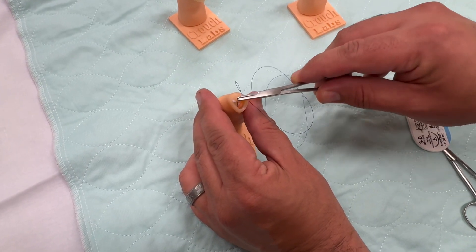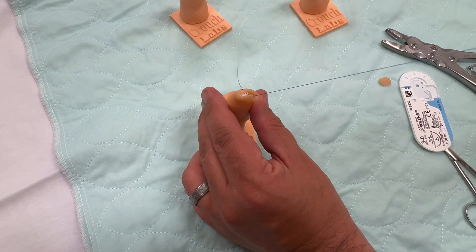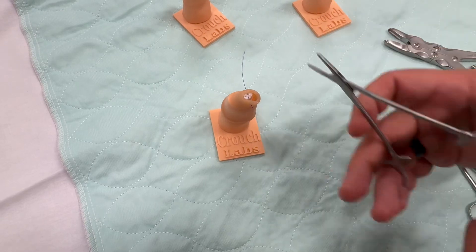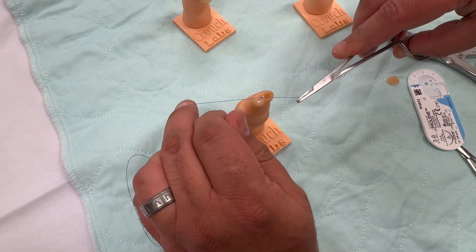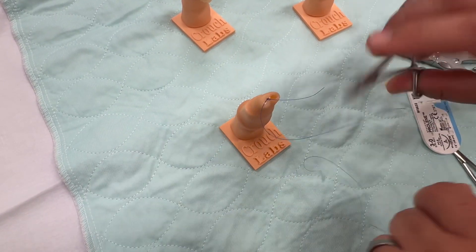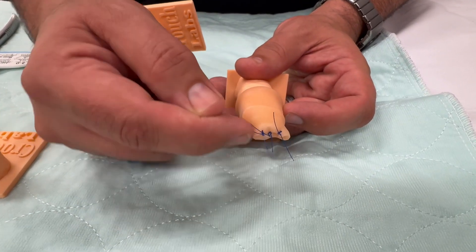You can first do simple practices where you're just doing simple passes over the top, and you can revise the edges if they have any dog ears, or you can do a V-to-Y plasty. As you close the silicone over it, it'll give you a very accurate view of what it's like to close these amputations when they occur.